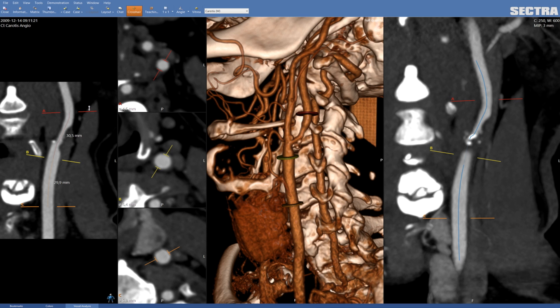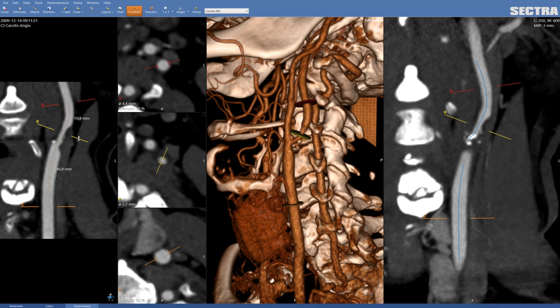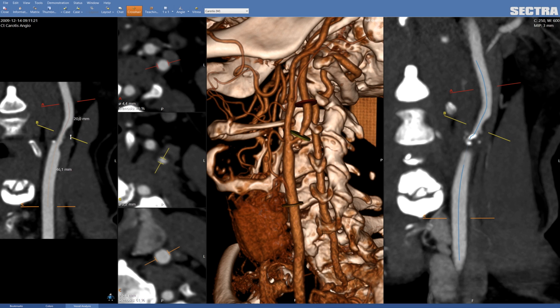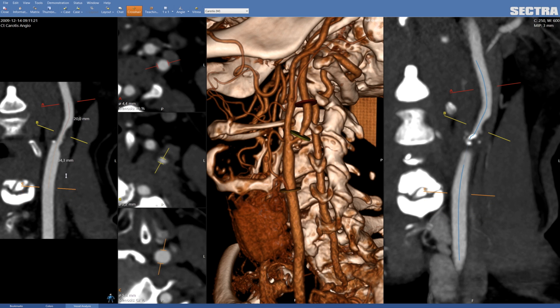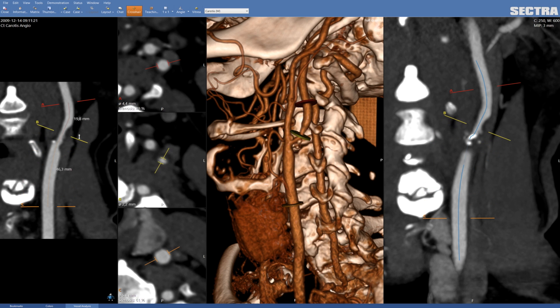If you put your cross-sectional markers over the area where you have normal lumen above the stenosis, then put the yellow one where you have the largest stenosis, and the orange one where you have normal lumen below the stenosis, you will automatically have the degree of stenosis calculated. You can see it here.